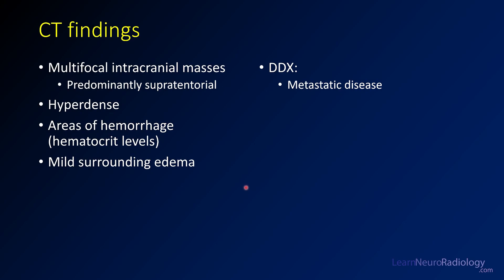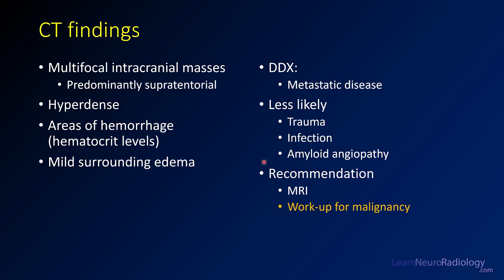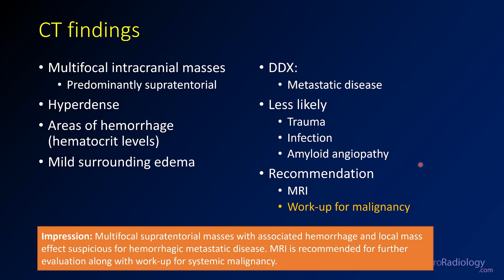The differential here — we have to think about metastatic disease. Other things: trauma, but the distribution is unusual, and if you had trauma this bad you would know from the history. Infections such as septic emboli can hemorrhage like this. Amyloid is definitely something to think about — you can have multiple hemorrhages, but this extent would be unusual. Definitely recommend an MRI and think about a systemic workup for malignancy. In your CT impression, describe this as multifocal supratentorial masses with hemorrhage and mass effect, suspicious for hemorrhagic metastatic disease. Recommend MRI of the brain to look for other lesions and work up for systemic malignancy.